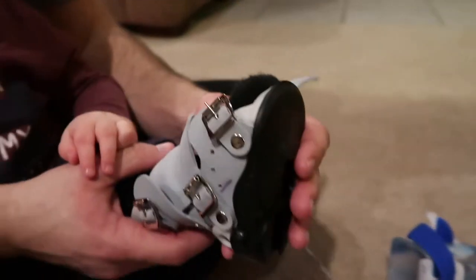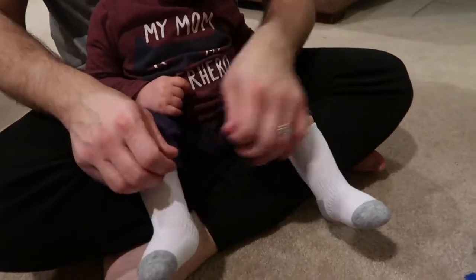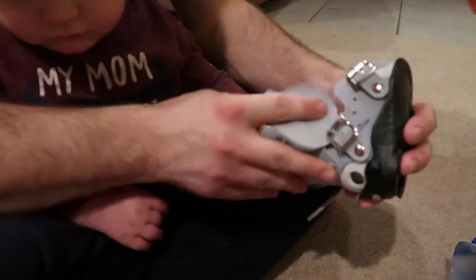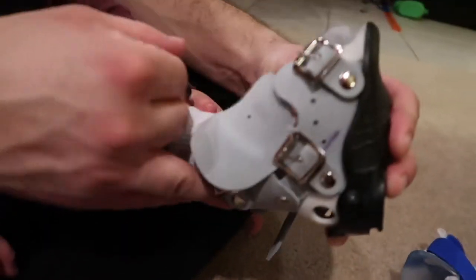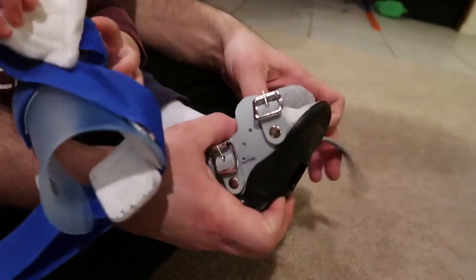We have switched to lighter colored socks so that you can see a little more easily. You get the heel set back in, just like you would if you were wearing a pair of boots — as far back as you can get it. Then take this flap and put it over while you're holding his heel in the back.